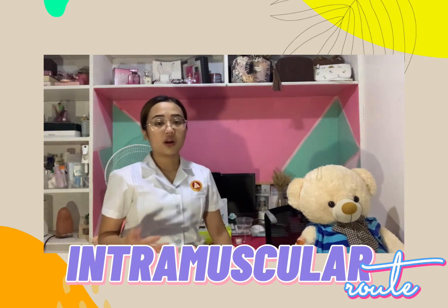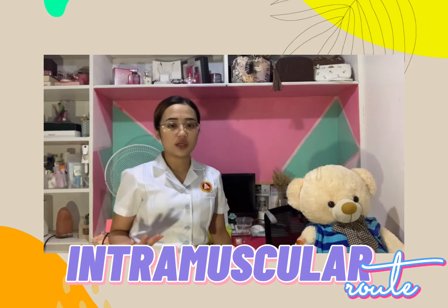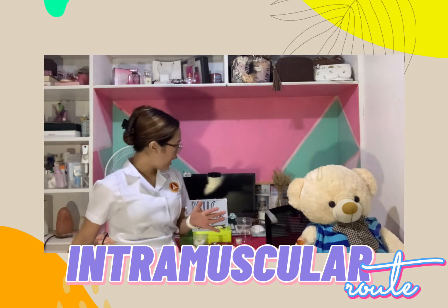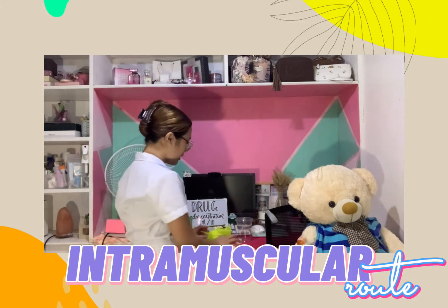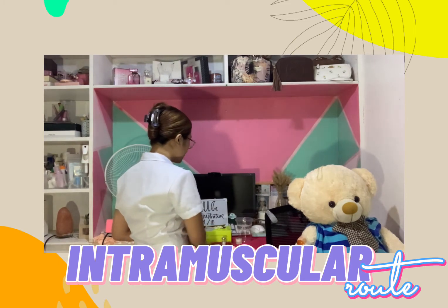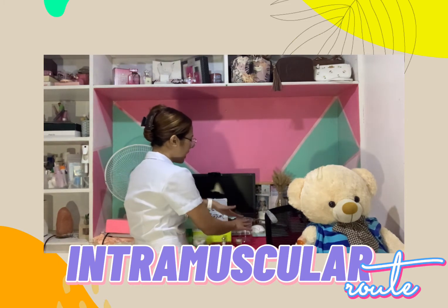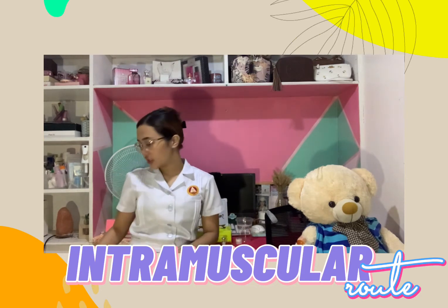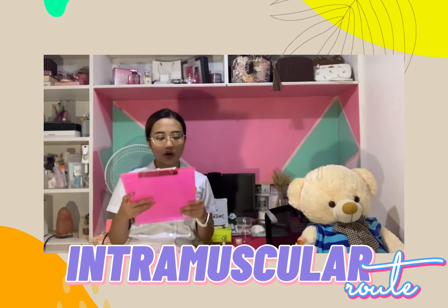We will prepare all of the equipment that is to be used. We will have our medication record, our medication tray with syringe, filter needle, vial, alcohol swab, wet and dry cotton balls, alcohol, gloves, sharps container, and micropore tape. After that, we will read the medication order against the label of the ordered medicine.